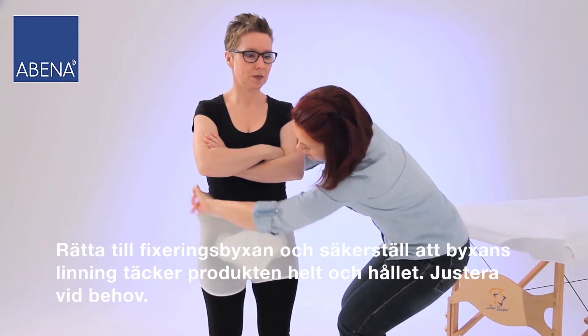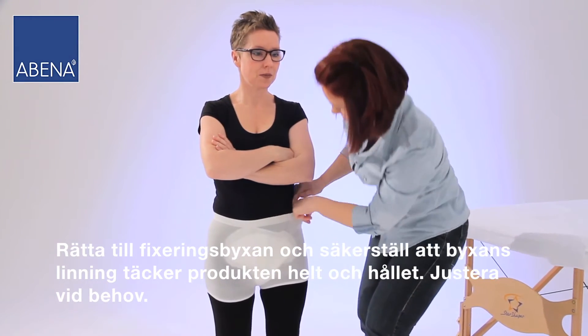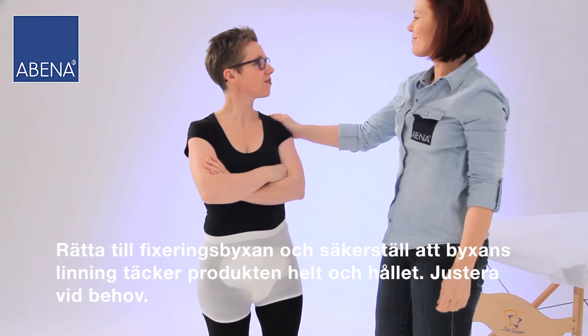Adjust the fitting pant and ensure that the waistline of the pant fully covers the product and correct it when necessary.